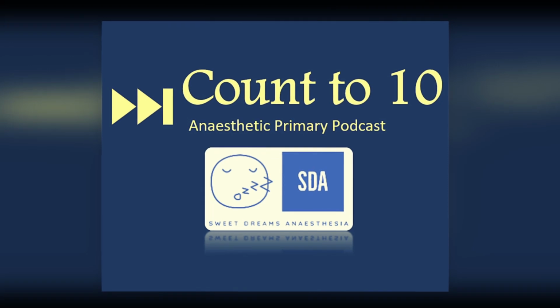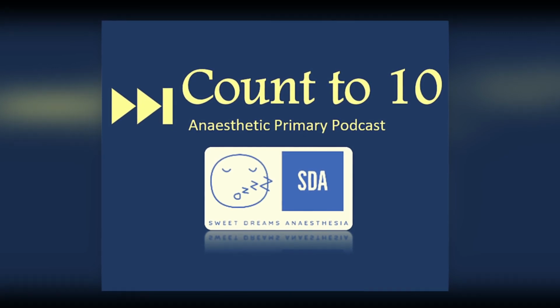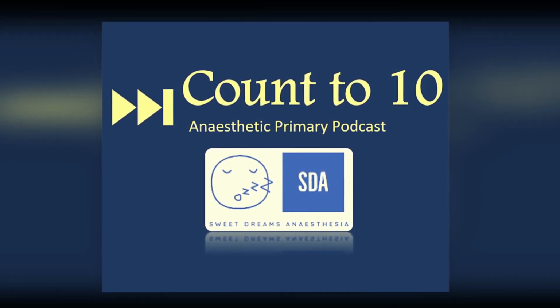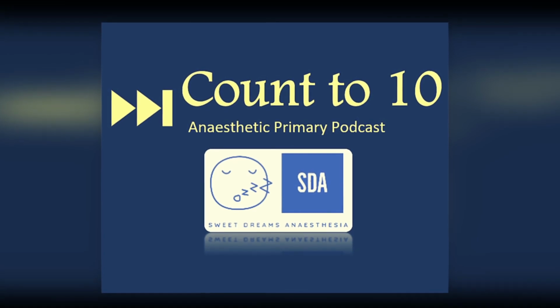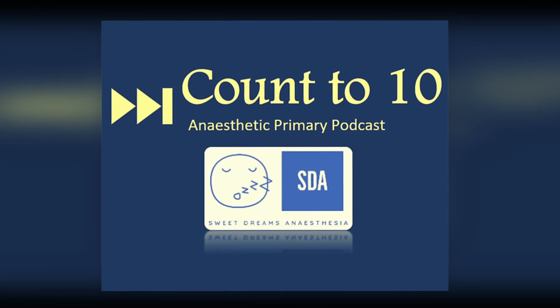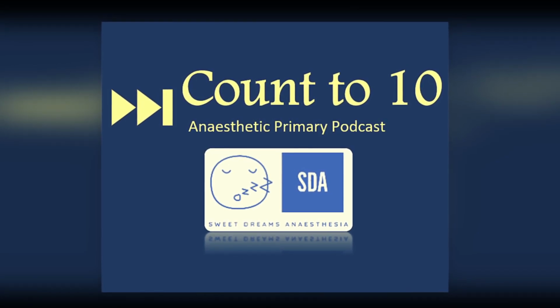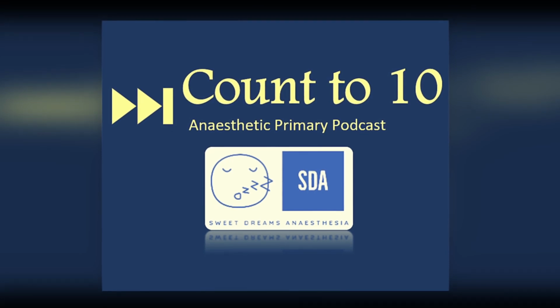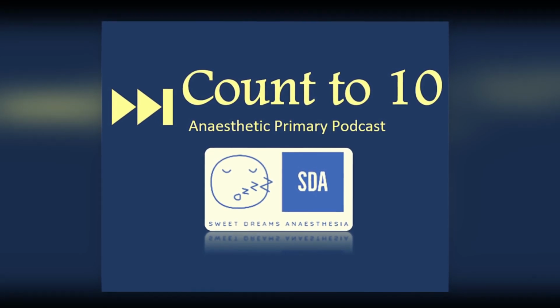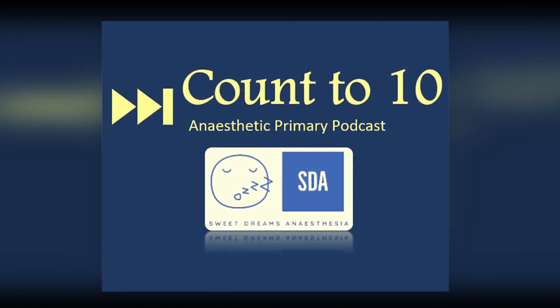The pulse oximeter has two unique lights. These are the infrared light and the red light. What makes this monitor unique is that oxyhemoglobin and deoxyhemoglobin have different absorbance of the different lights. Oxyhemoglobin absorbs more of the infrared light, while deoxyhemoglobin absorbs more of the red light. So we can use this knowledge and our knowledge of the Beer-Lambert law to then give us a number that represents the percentage of oxygen that's bound to oxyhemoglobin.